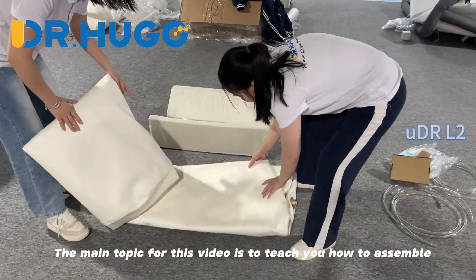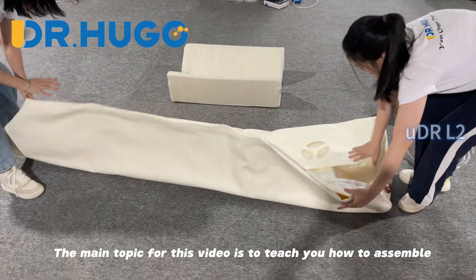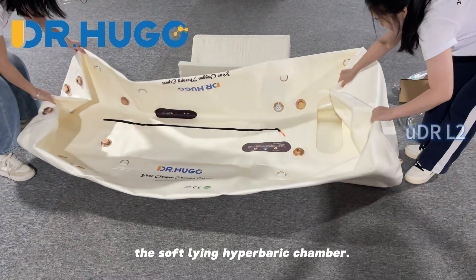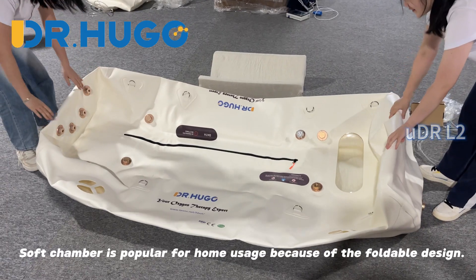Hi, everyone. The main topic for this video is to teach you how to assemble the soft lying hyperbaric chamber. Soft chamber is popular for home usage because of the foldable design.